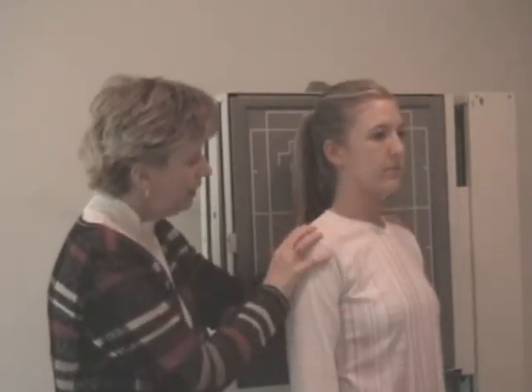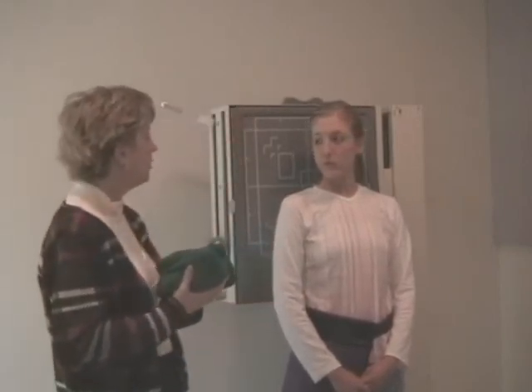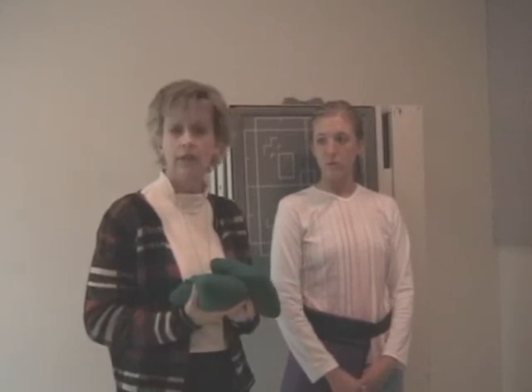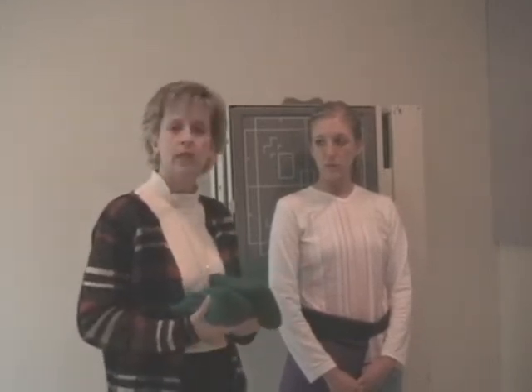So you're going to work on getting the patient's shoulders relaxed. And I'm going to put sandbags out here. I don't recommend the use of sandbags on every patient, for personal reasons. My sister, small in stature like Kristen, was given weights to hold for the lateral, and she was so small that these weights, which can be 5 to 10 pounds each, actually caused motion on her. And she had a long enough neck that her shoulders weren't a problem. So giving patients weights on a routine basis might cause you a problem with motion issues.